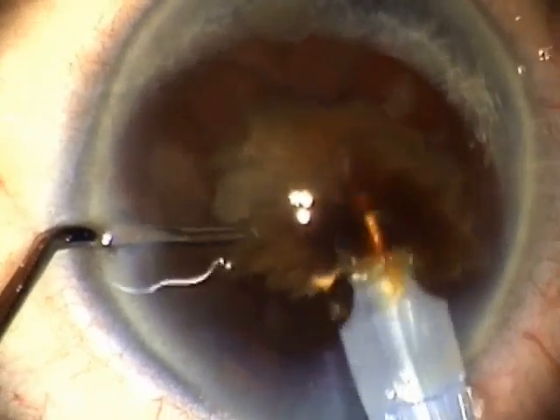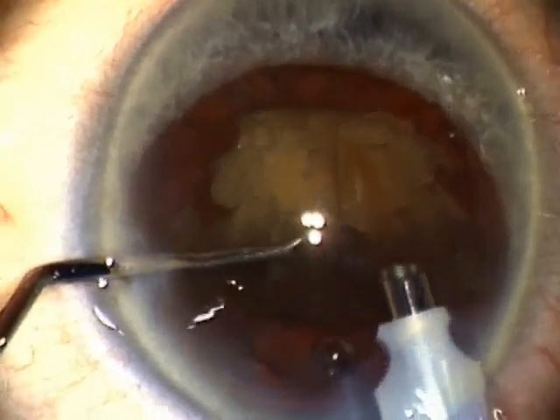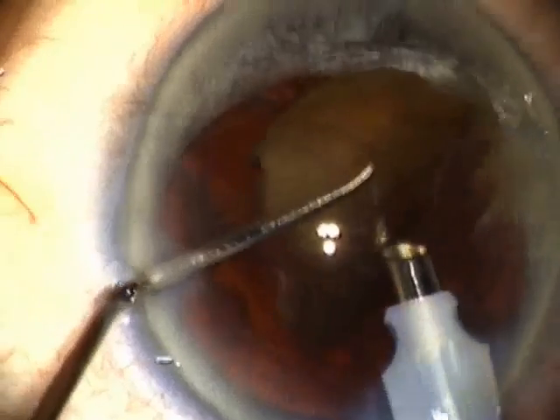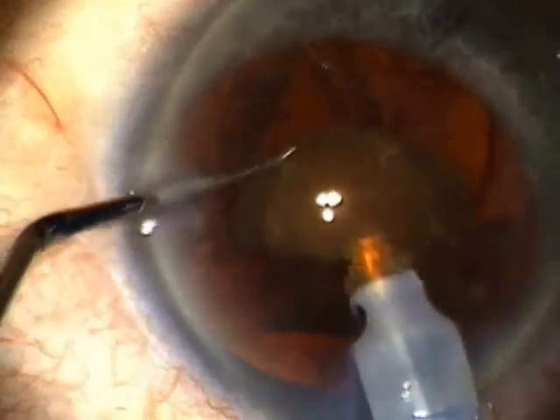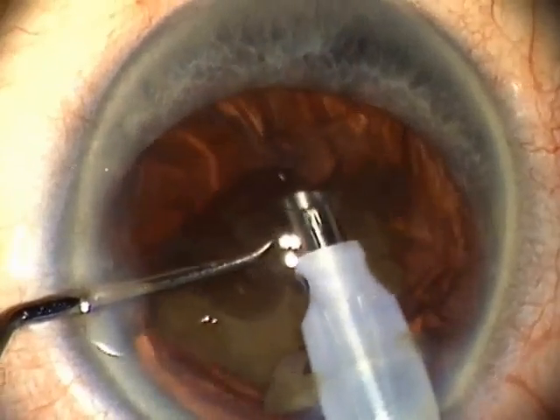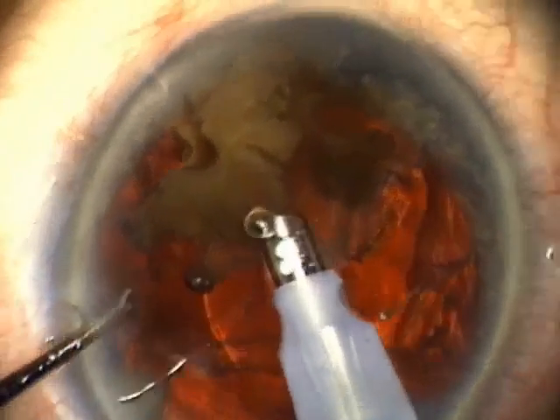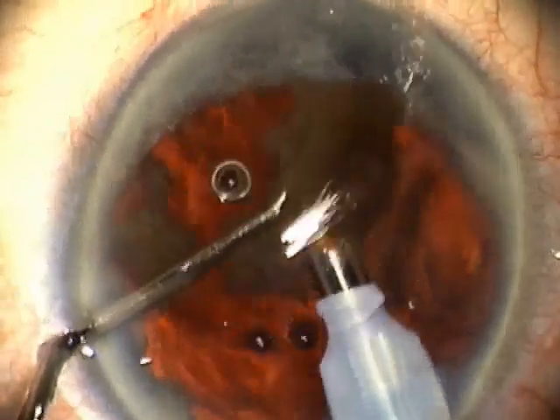This is another very dense lens, again demonstrating the exquisite power of the Stellaris system. I would not even want to attempt removing these lenses with a different FACO system. David Brown's FACO flip offers a real advantage in that you're able to do the softer part of the lens slowly and gradually — by continuing to carousel the lens around, you work it to the point where you get to this small central core. The Stellaris system can then be used in that continuous FACO mode to more rapidly remove the very densest part of the cataract.